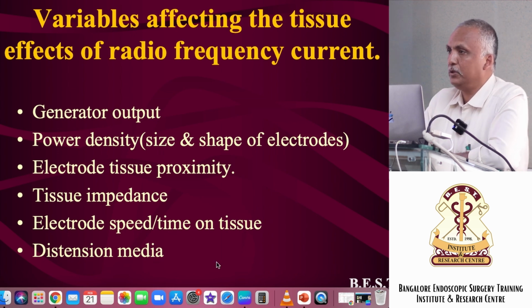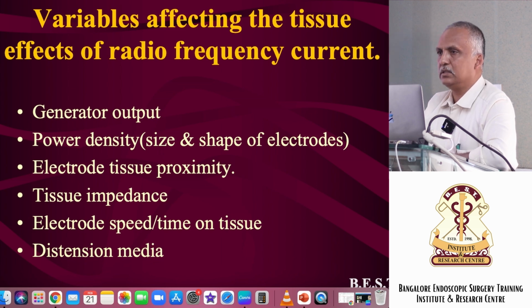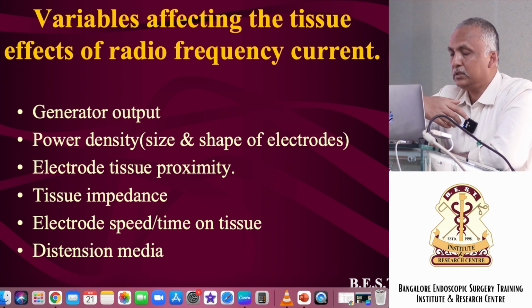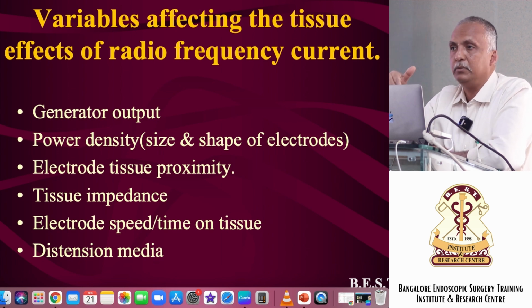And then in laparoscopy, you have to remember we use carbon dioxide, and carbon dioxide retards electrosurgery effect. So, supposing you are doing a laparoscopic surgery and then immediately you have an open surgery, and you put the pencil and start, you see suddenly it works so much more than what was happening in your laparoscopy.